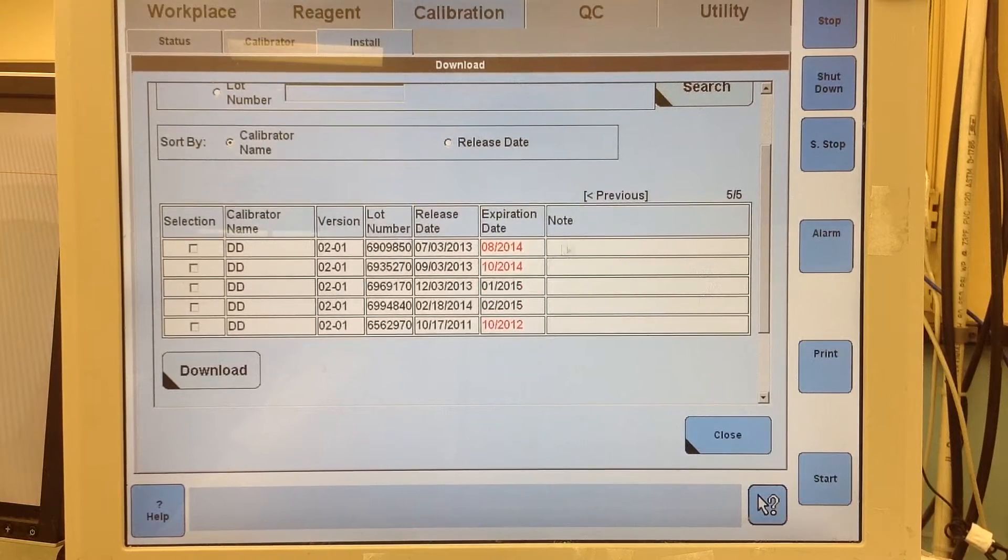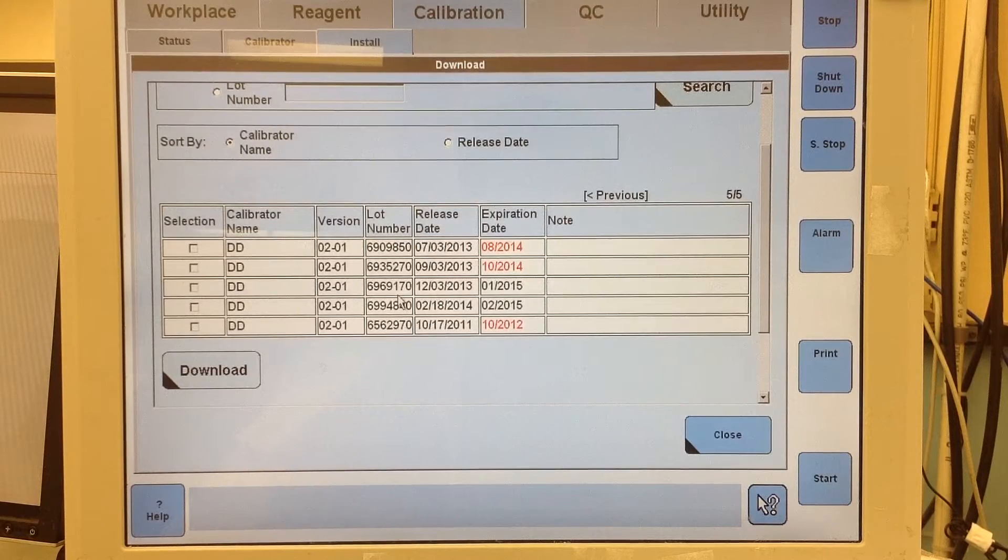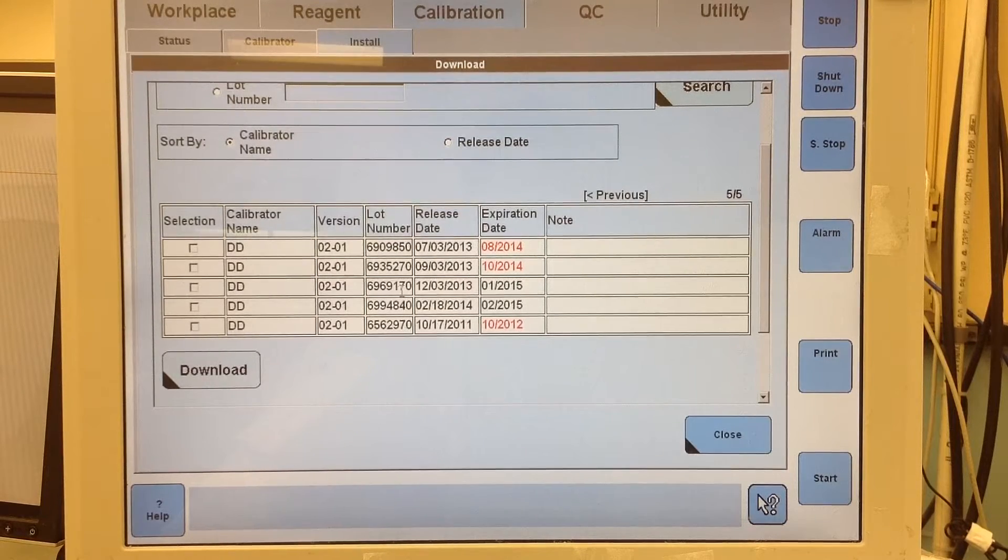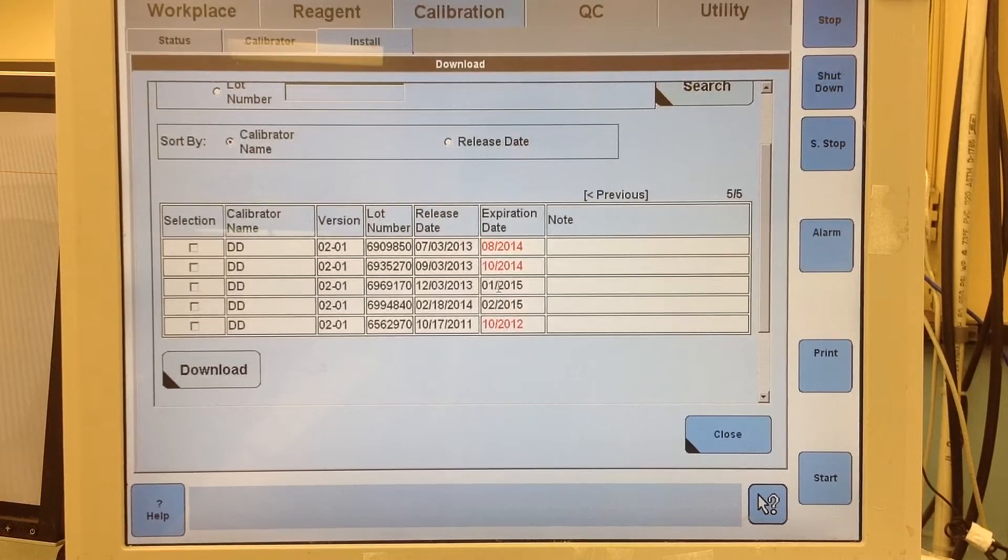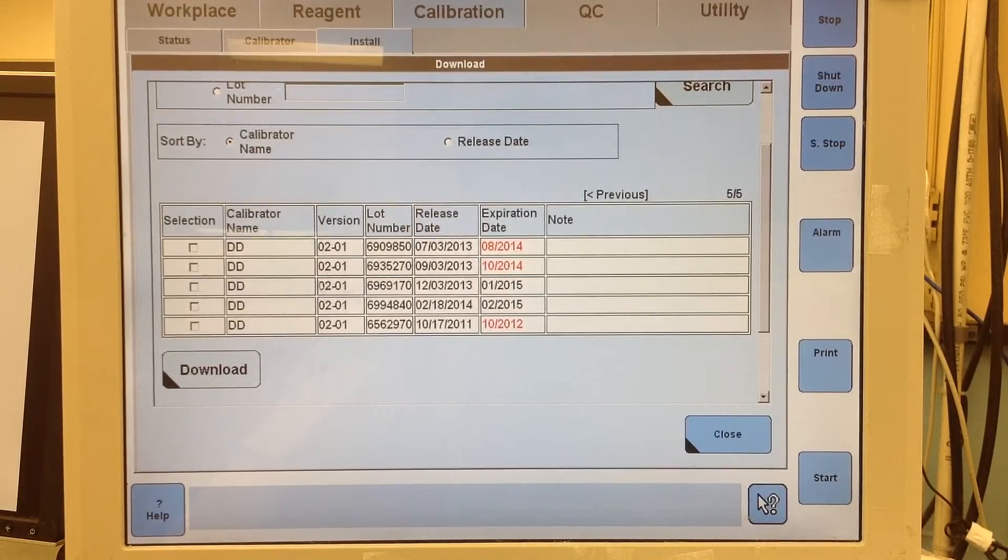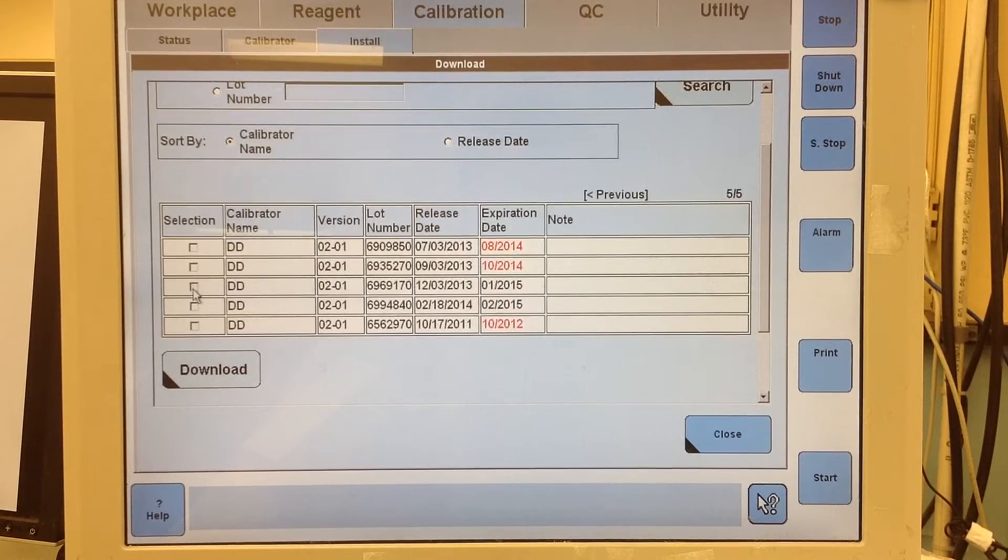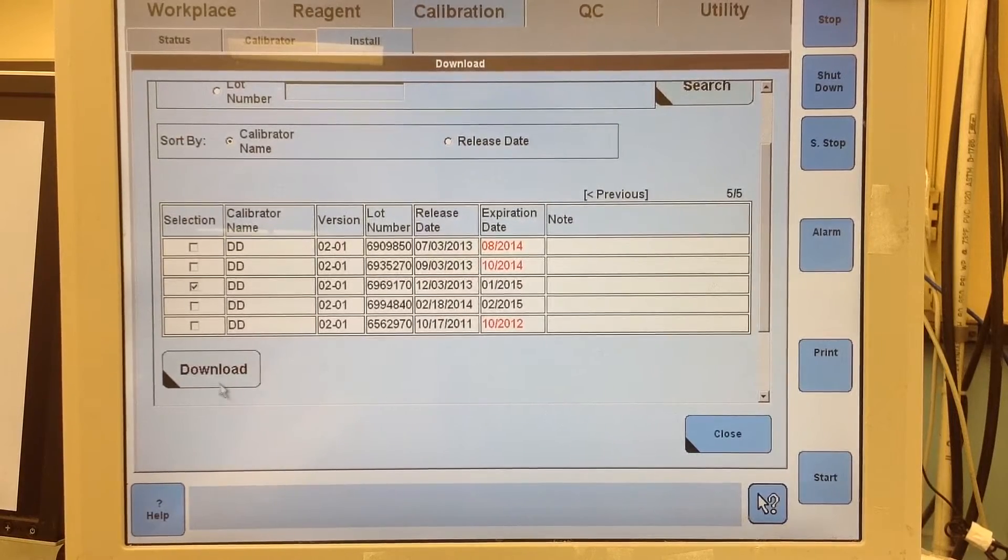So there we go. It's going to be this one right here, 696170. And I'll check the expiration to make sure that it is January 1, 2015. It is.